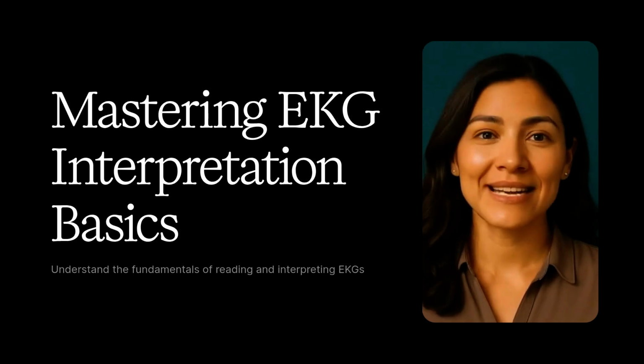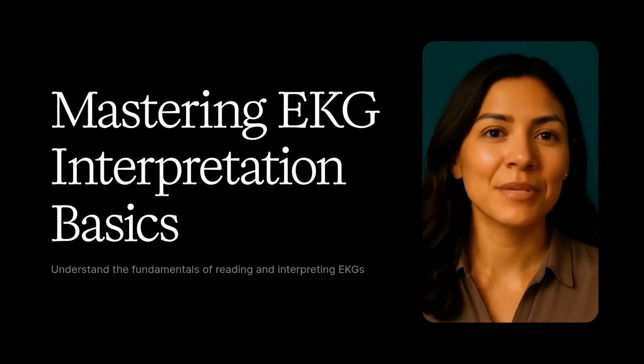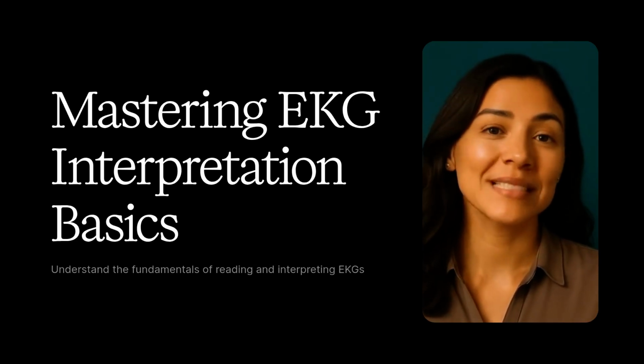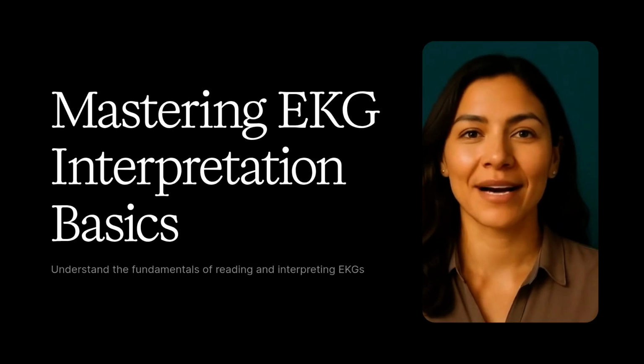Welcome to Mastering EKG Interpretation Basics, where we'll guide you through understanding the fundamentals of reading and interpreting electrocardiograms. This comprehensive course will equip you with essential skills needed for accurate EKG analysis in clinical practice.